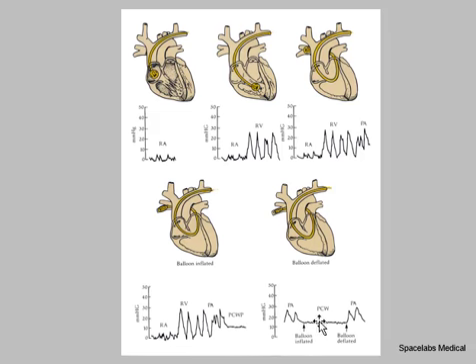It doesn't have to be perfect. You have to be satisfied that it's a wedge, and there are ways of testing for that. And then you do a reverse of the pressures, first to confirm that they're the same as they were on entry, although, as I've said, most operators tend to go straight into the wedge and record the pressure there.